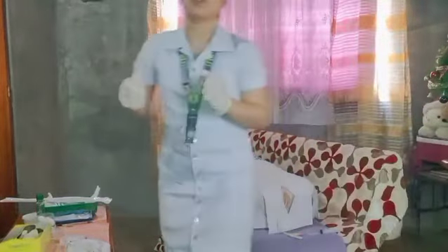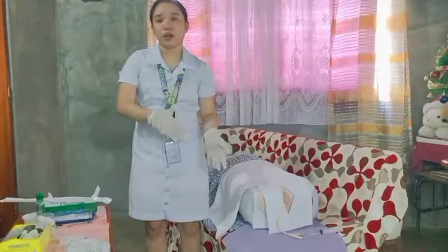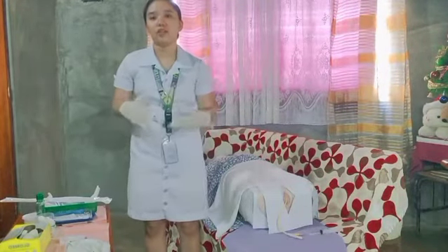So, then slowly inflate the balloon using a prefilled syringe. The rationale, the size of the balloon is marked on the catheter.